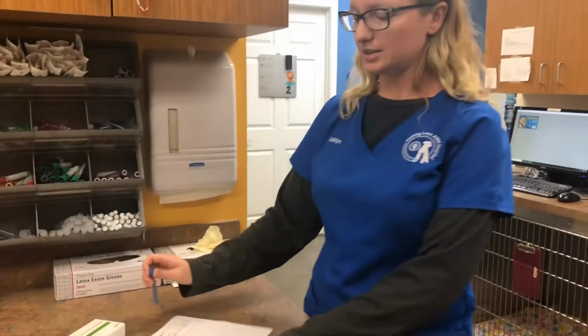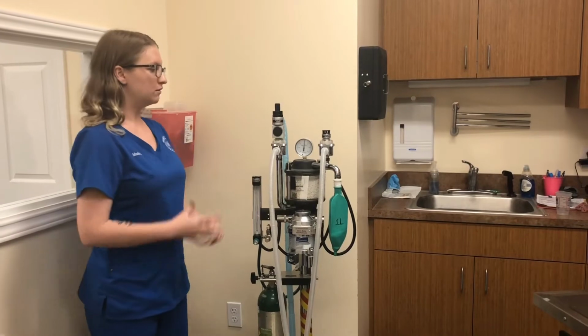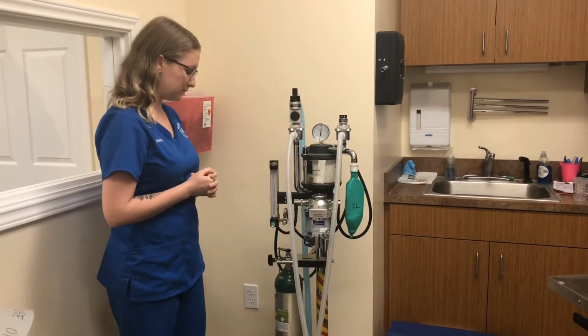And that's how you enter a drug onto a controlled substance log. Okay, now I'll be going over our anesthesia machine. This is one of the ones that we have here at our clinic, and I'll go step by step through each part of the machine.